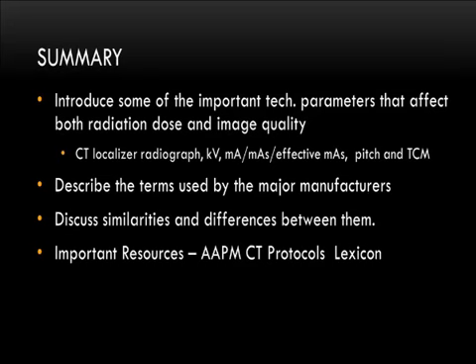The quality reference mAs does not need to be adjusted by patient, but it should be adjusted by clinical indication or the purpose of the exam. So the idea is to maintain image quality across an individual exam. So if you're doing a routine CT abdomen and pelvis, that quality reference mAs should work for patients of different size. You don't need to adjust that. But if you're doing a high-resolution chest, then you may look for a different quality reference mAs setting.